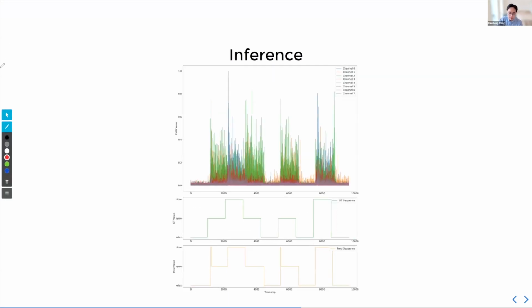So let's take a look at one of the signals here. This is EMG sampled at 200 Hertz. I will say that we can actually run inference at 200 Hertz, but we do not do that. We actually run it at a much lower frequency to prevent a failure case that's very common only in the online setting. If you do this offline, it's not a problem. But if you think about controlling the device and using this in an online real-time setup, it starts to matter a lot.